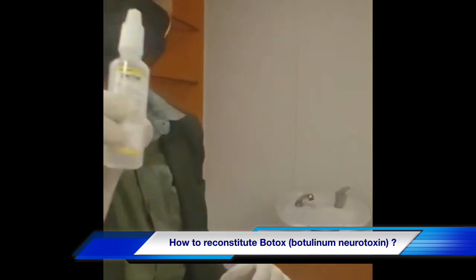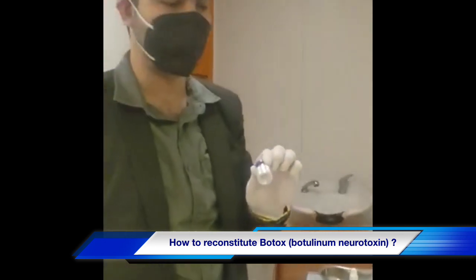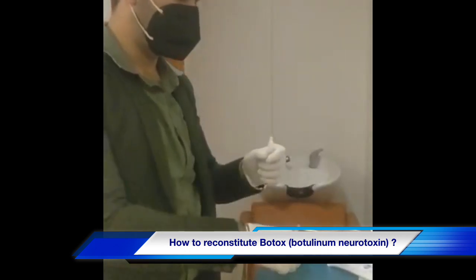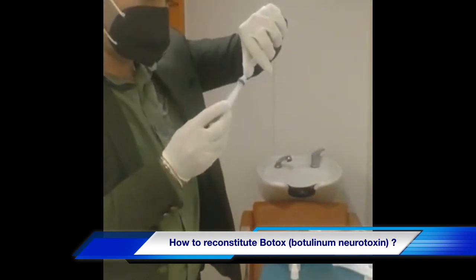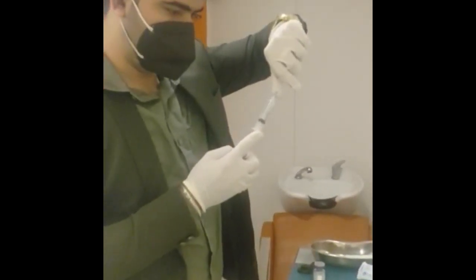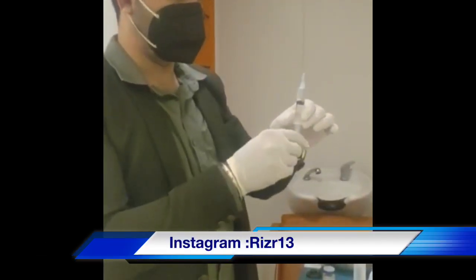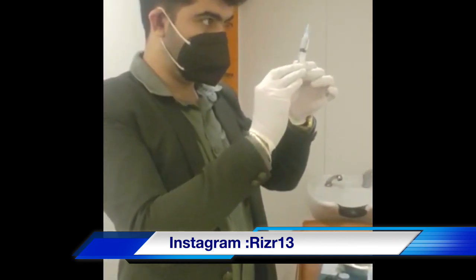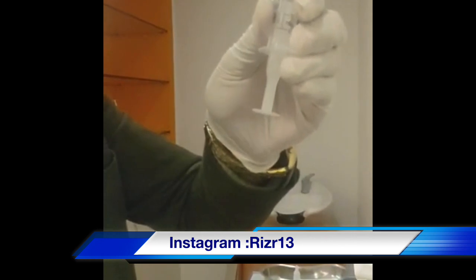We will reconstitute it with 0.9% normal saline, and for 100 units we use 2.5ml of normal saline to reconstitute it. We open our syringe and load 2.5ml of saline into it like this. We shut out the excess and make sure there is no air bubble trapped inside. As you can see here, you can confirm 2.5ml of saline.